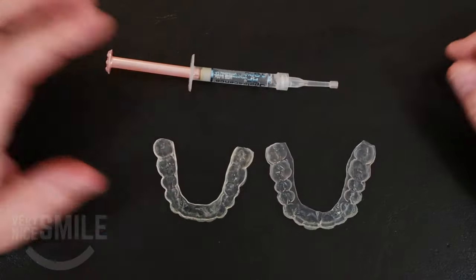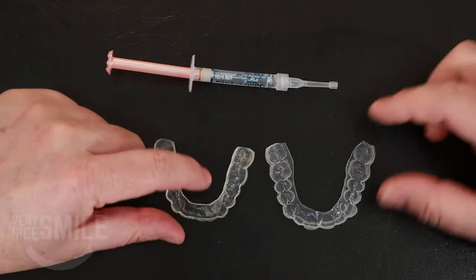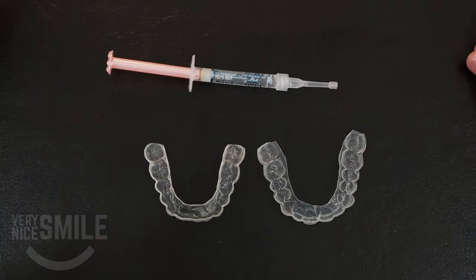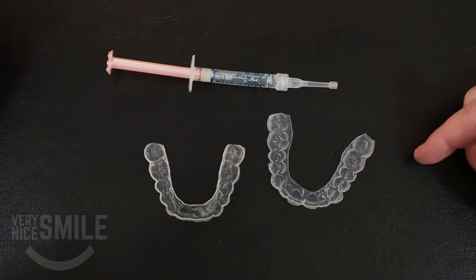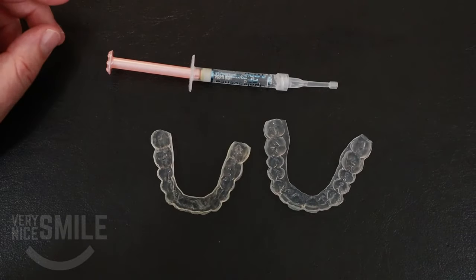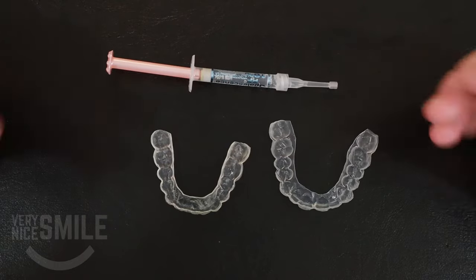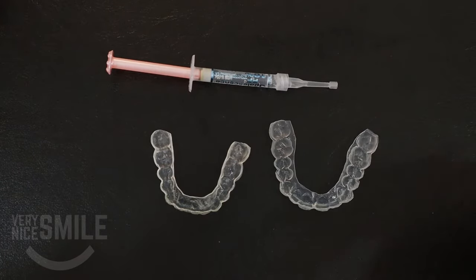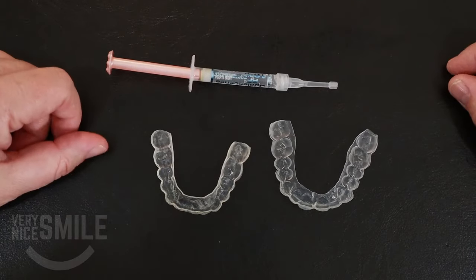So this is how I like to load them, and I will show you how to load them. I'll show you how to insert them properly and then I'll also show you how to clean them afterwards, so that you can get as much life out of them as you can. If you take care of these bleaching trays, you can actually use them for a really long time and you won't necessarily need to get a new set made unless you have some major changes, like you get a couple crowns replaced or you lose a tooth.